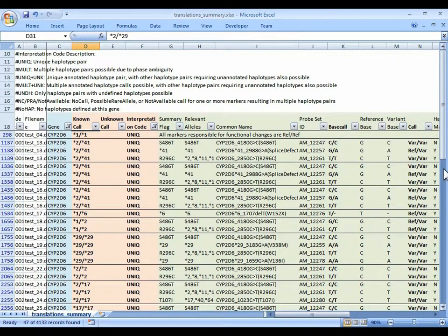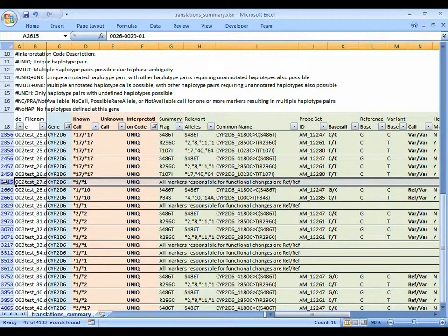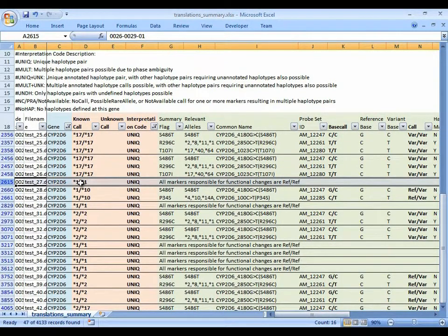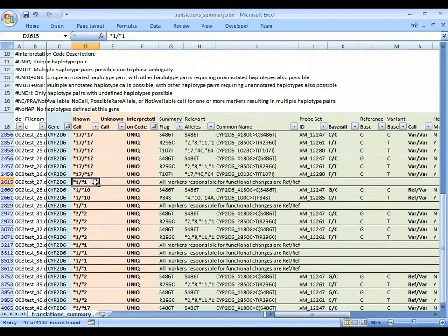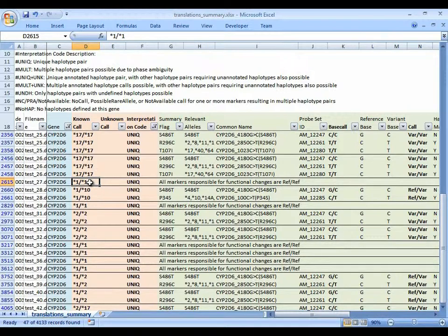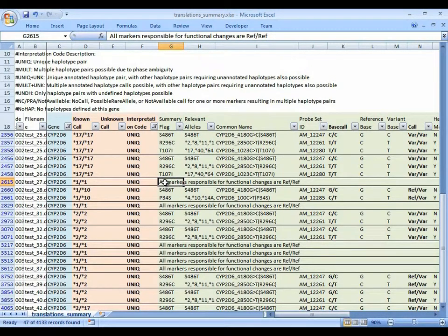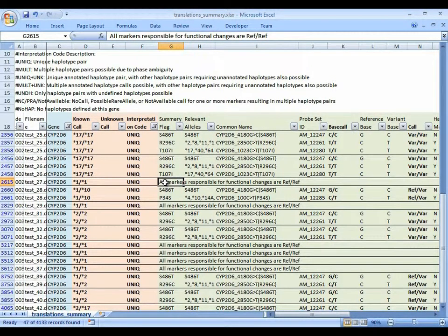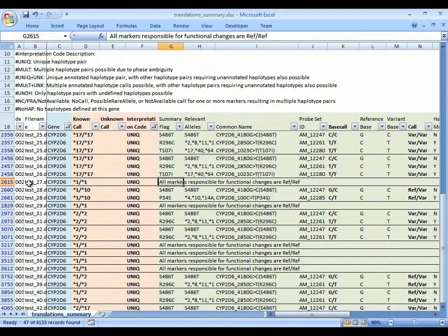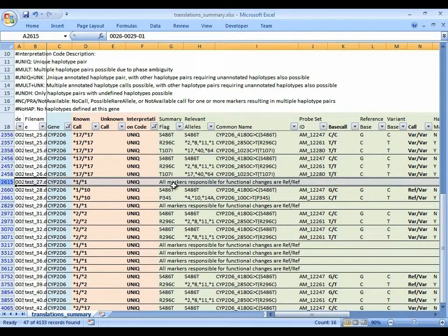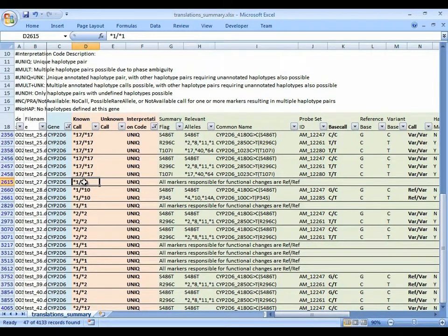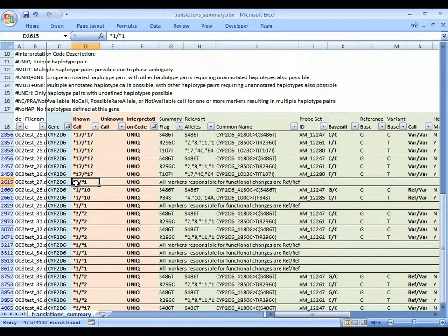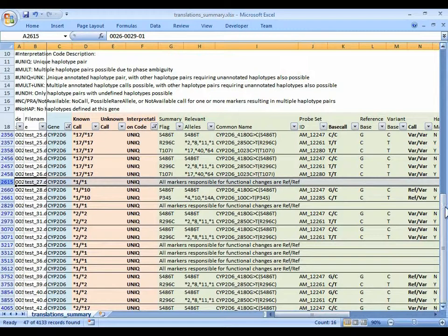Let's start with this row. So we have star 1, star 1 being called. It's been given unique code because that's the only known call that can be reported based on the observed genotypes. And the marker information is actually abbreviated down to only a sentence. All markers responsible for functional changes are ref, ref. In other words, there are no variant markers for this sample that influence, that impact the function of the gene. This is what's called the wild type allele. It's called star 1, star 1. And in the summary report, that's the only information you get.